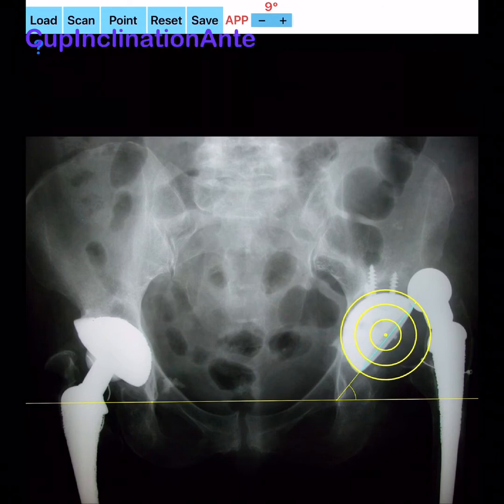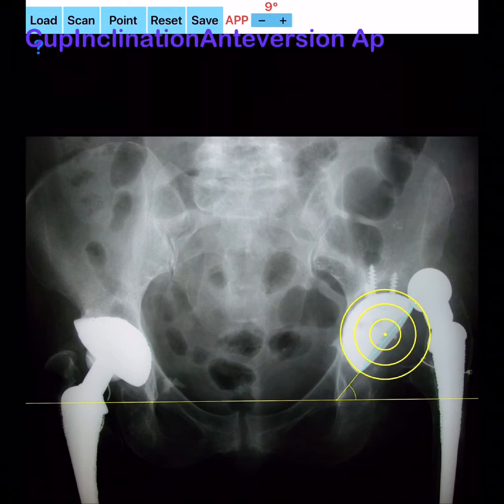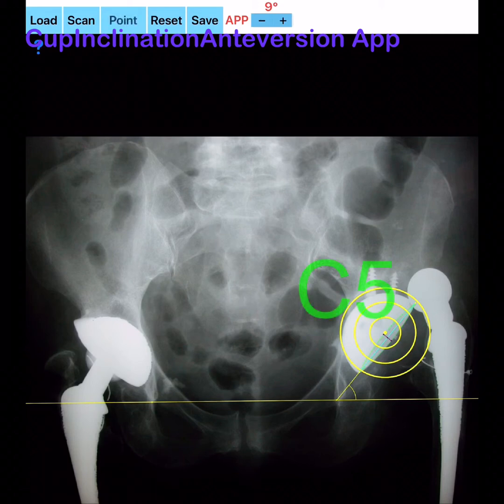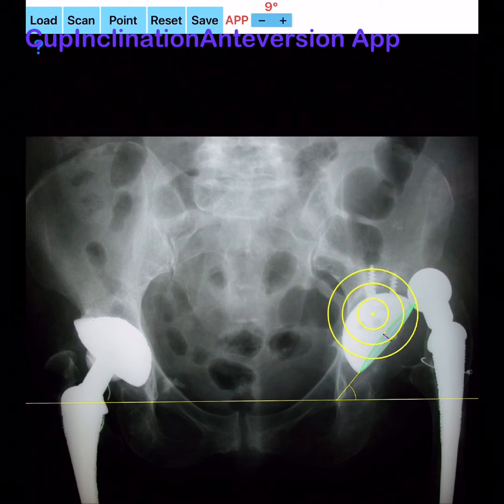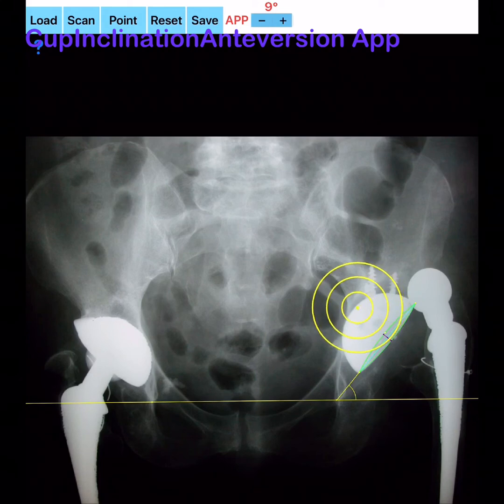By aiming at the most caudal lip of the acetabular component — noting that absorption of X-rays by metallic prosthetic heads may disguise part of the upper lip of the ellipse — you mark the C5 point. A green-colored ellipse of the acetabular component is drawn, and the short axis, shown as a purple line perpendicular to the long axis C3–C4, is depicted.